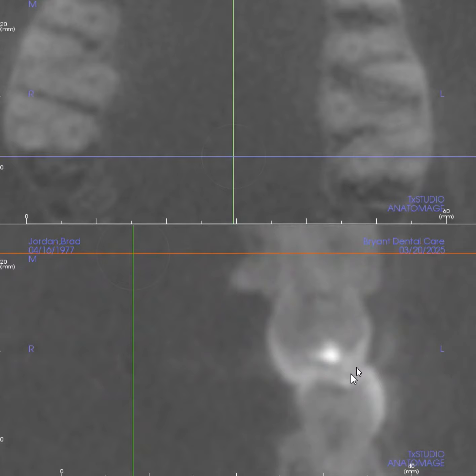And then I remove all of the red, and you're likely to see a lot of red kind of on this buccal incline surface of number 15, and possibly right here on the buccal incline of the palatal cusp, or much more. If you don't see anything, let me know, and we'll discuss some next steps on how we can come to a more definitive diagnosis. But I would start there.